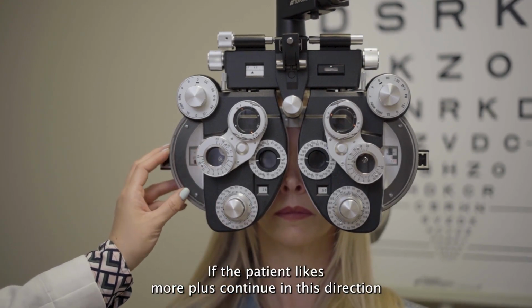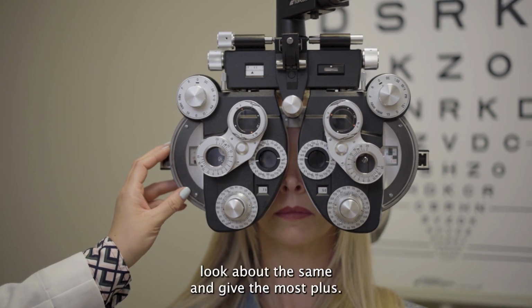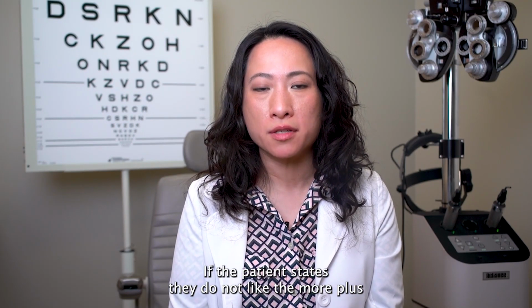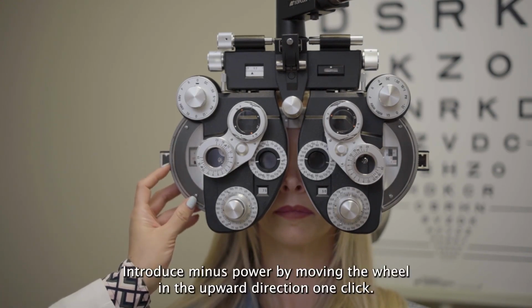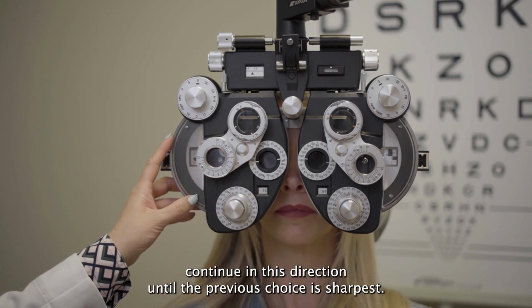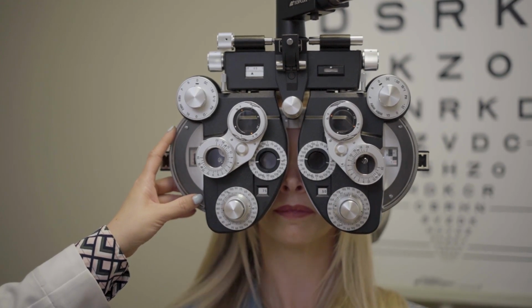If the patient likes more plus, continue in this direction until the previous choice is sharpest. If there's any confusion, ask if the choices look about the same, and give the most plus. If the patient states they do not like the more plus option versus the starting power, return to the starting point, and this is choice 1. Introduce minus power by moving the wheel in the upward direction 1 click. This is choice 2. If the patient likes more minus, continue in this direction until the previous choice is sharpest. If there is any confusion, ask if the choices look about the same and give the more plus option.